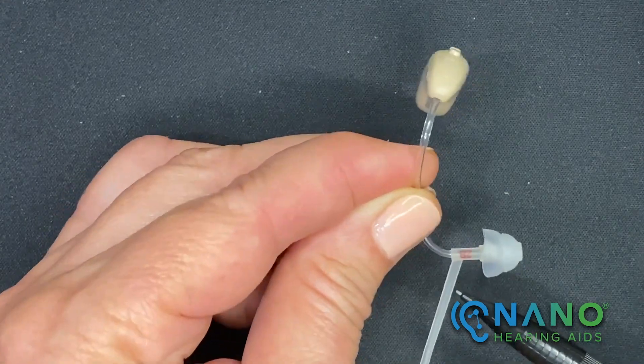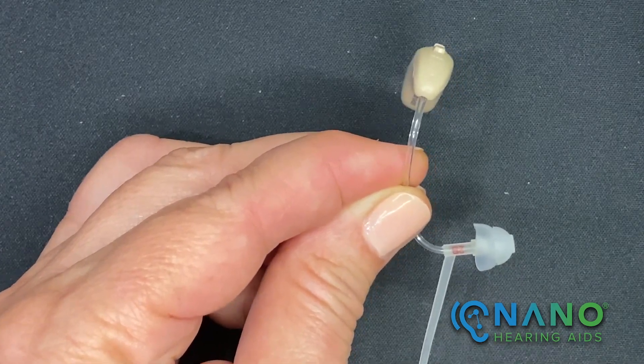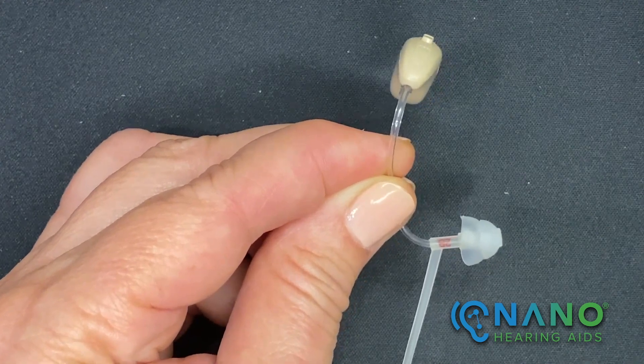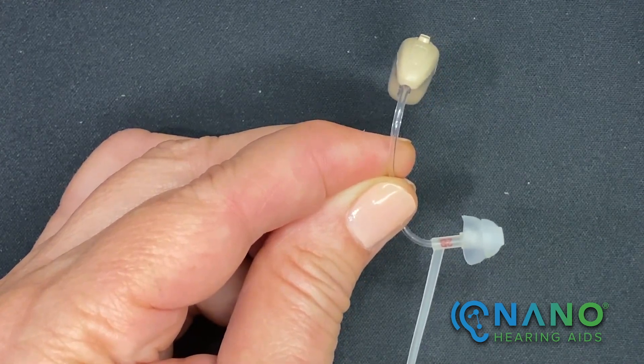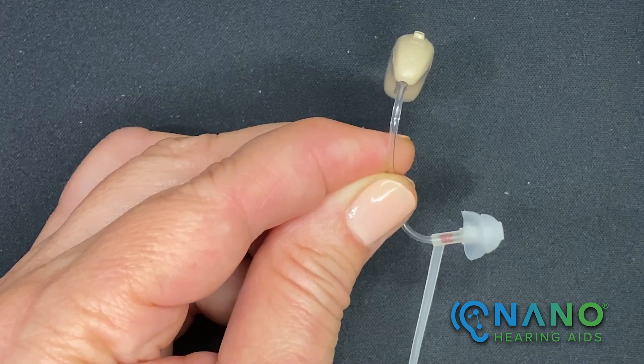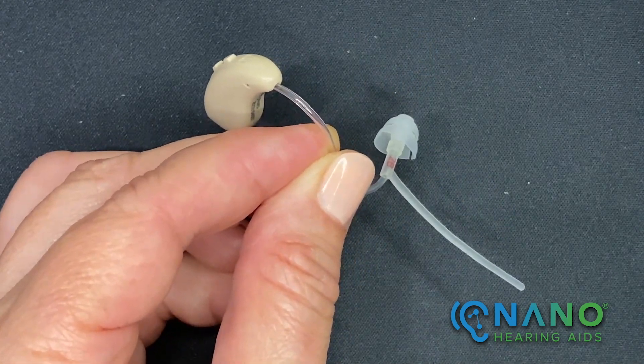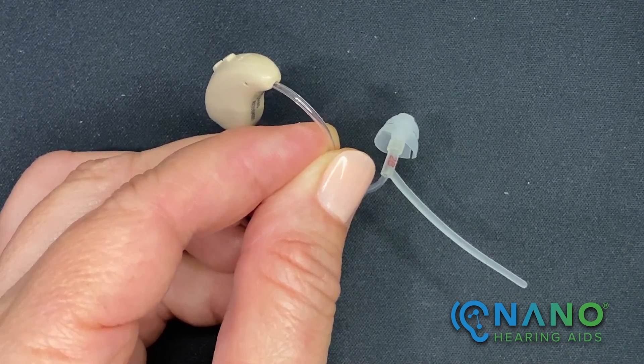This thin plastic piece that's attached to the thin tube is a stabilizer. It's used to keep the dome and the thin tube in place. It'll sit in the curvature of your ear just outside of the ear canal. Please refer to the user manual for more information on the stabilizer.